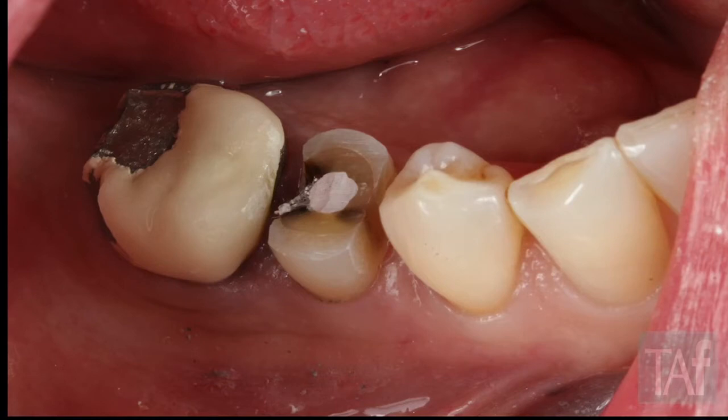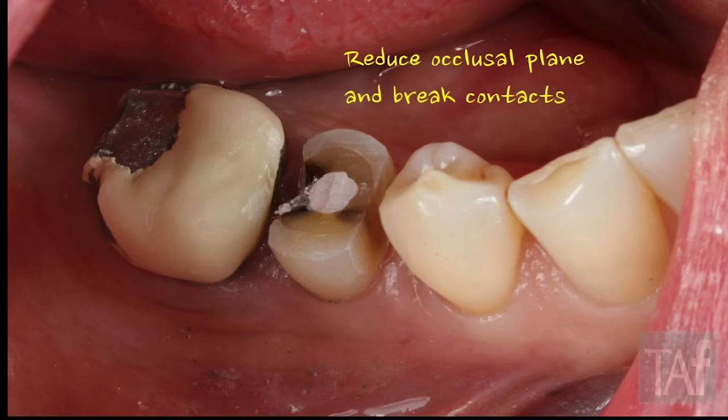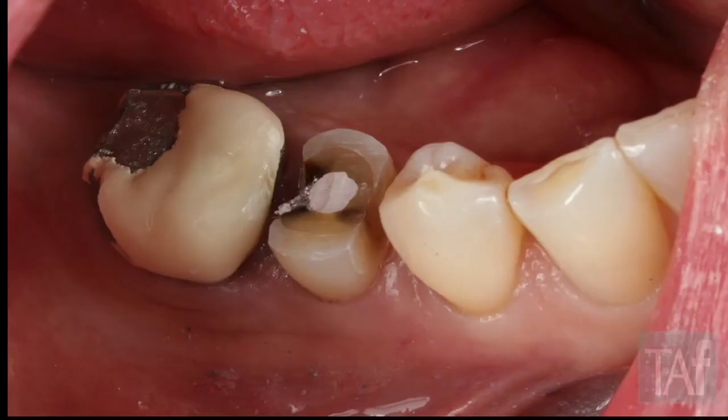After the depth cut, I take the barrel bur on the occlusal table and get as close to the adjacent teeth as I feel comfortable, getting the rest of the occlusal table gone. Now when I go to do my reduced occlusal plane and break my contacts, there's not as much tooth structure to manage. You can also see things a lot more clearly — you're not dealing with that rounded marginal ridge and worrying about the contact because that's already gone. So: bury the bur, break the occlusal table down, then hit your contacts.